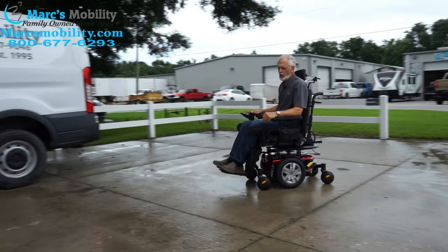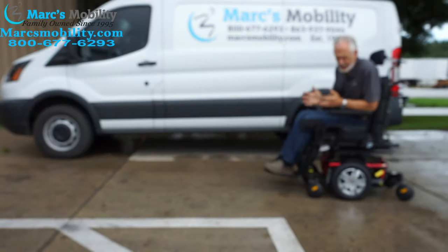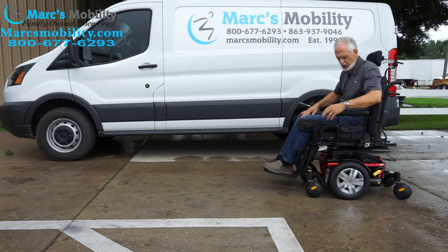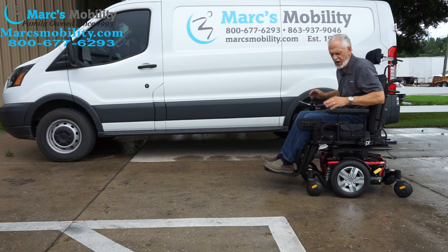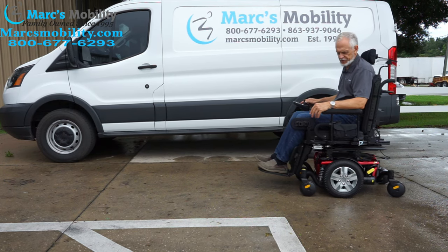So this is the Jazzy J4 power chair with electric tilt, electric recline, practically brand new, with knee guards. It has the big 20 by 20 seat, which we're not going to change. Just a really nice power chair.